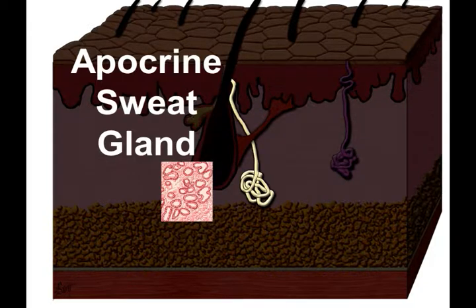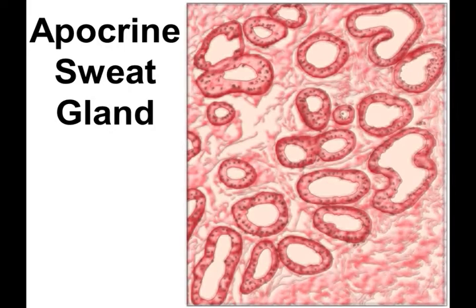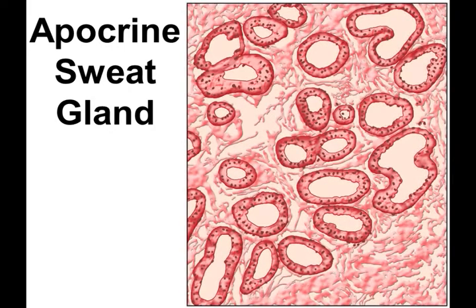The apocrine sweat gland is associated with the pilosebaceous unit. Apocrine sweat is more visible and is fairly brightly eosinophilic, often noted within the lumens, not seen on this particular schematic. When not visible, it looks like this schematic, where you have very large soap bubble-like lumens.